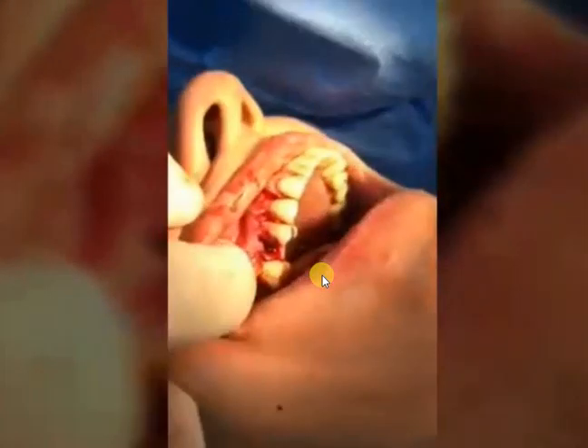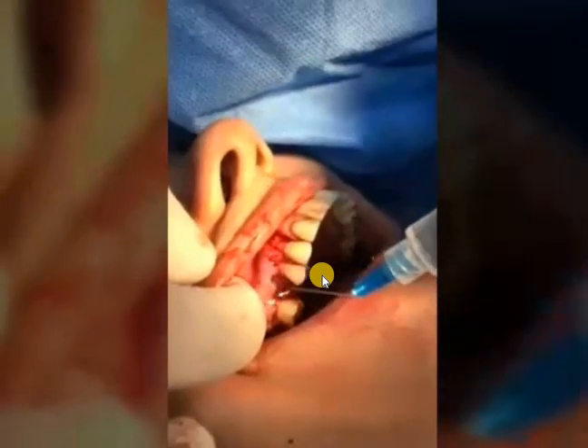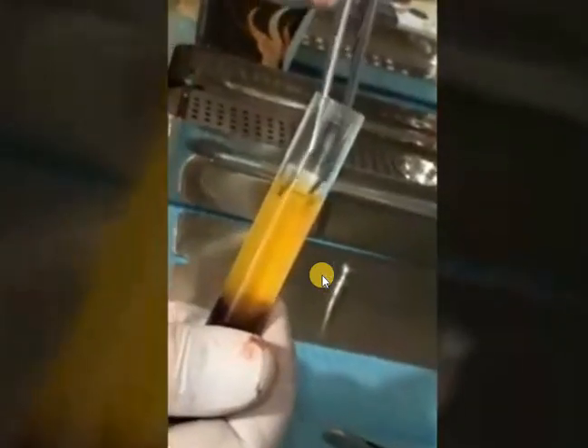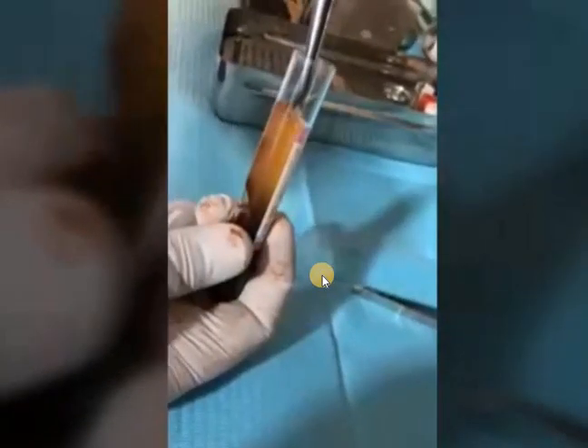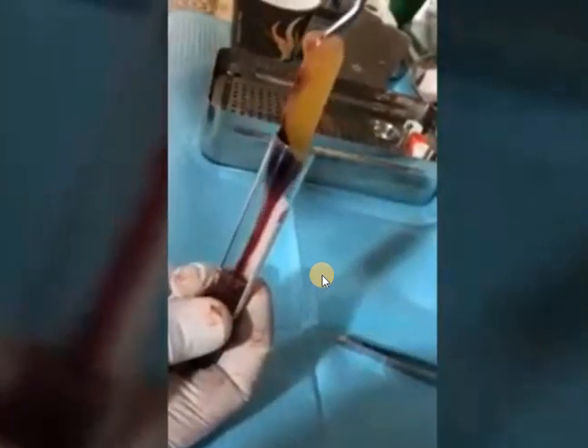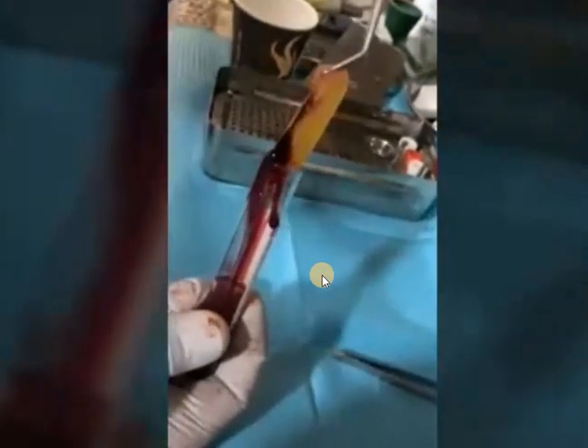We remove the granulation tissue with a surgical excavator and use irrigation. This is the PRF — we took 10 ml of the patient's blood, centrifuged it, then pressed it in the metal pack to drain the plasma and obtain the PRF membranes. We use the plasma mixed with the bone and the PRF membrane placed over the bone.